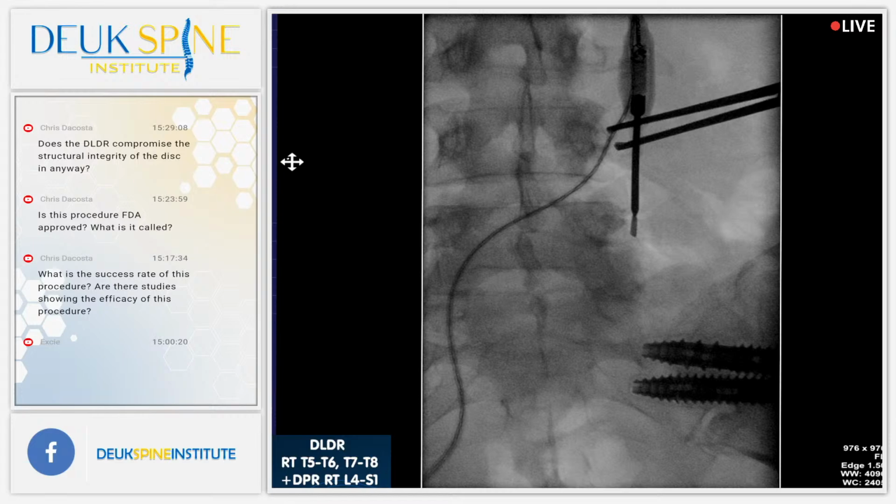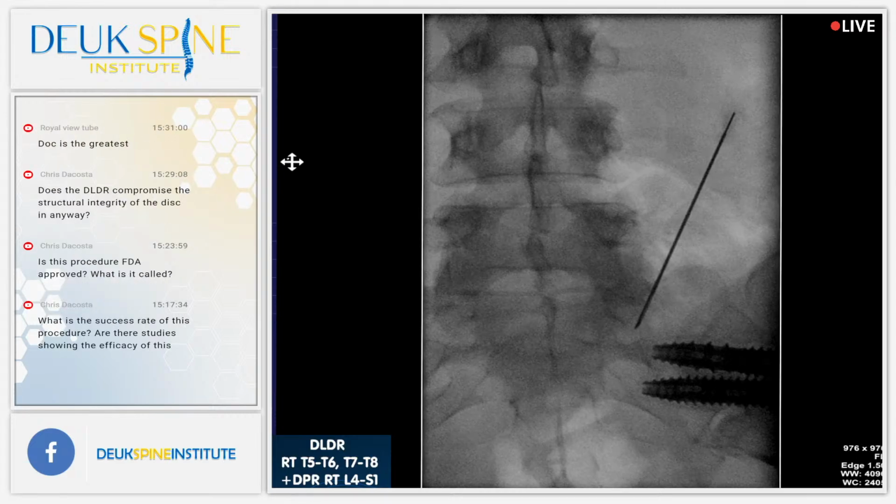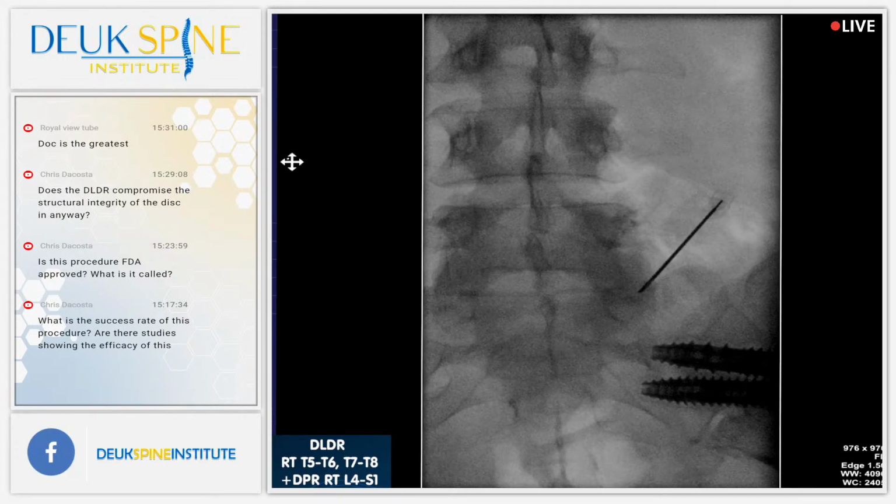How is she? Doing great. All right, so we got L5-S1, we got the S1 next. Boy, look how arthritic the L5-S1 facet is. You guys see that? Huge arthritis there. Yeah, show us the target. That's right, right there. A little bit to the left. Right there. That's our target. If I can get to that spot, then we can have the best possible result. Shot. Too low. Shot. Shot. Getting closer.